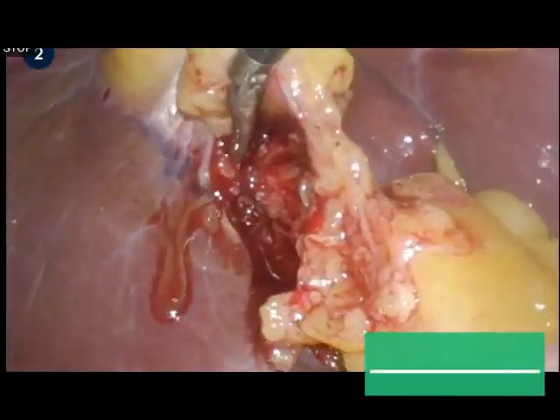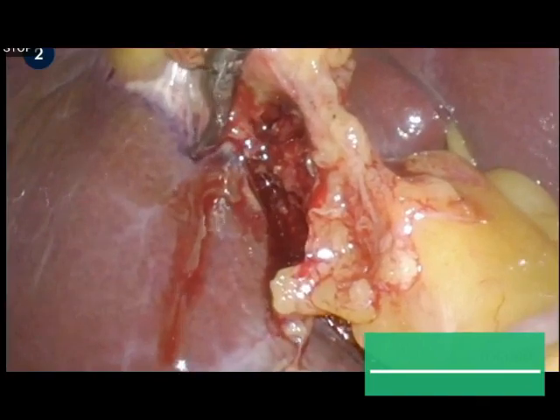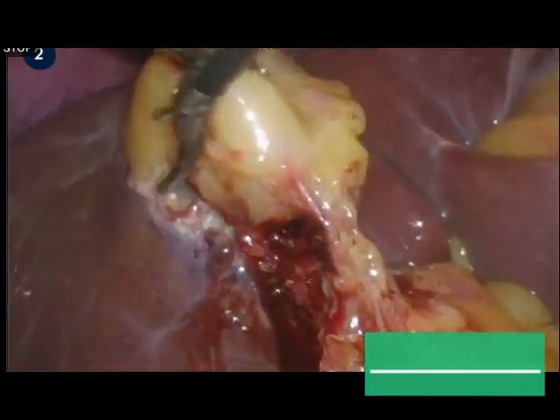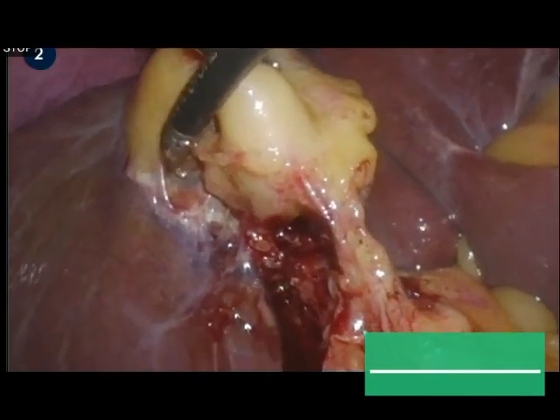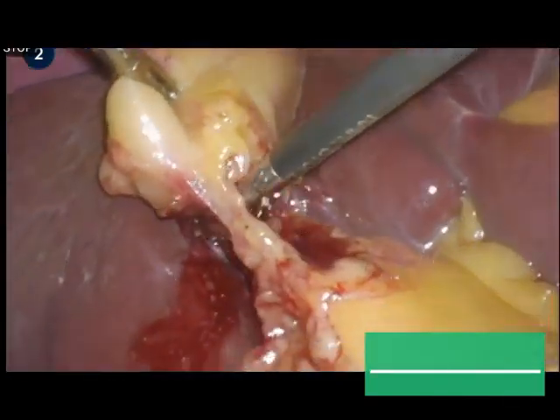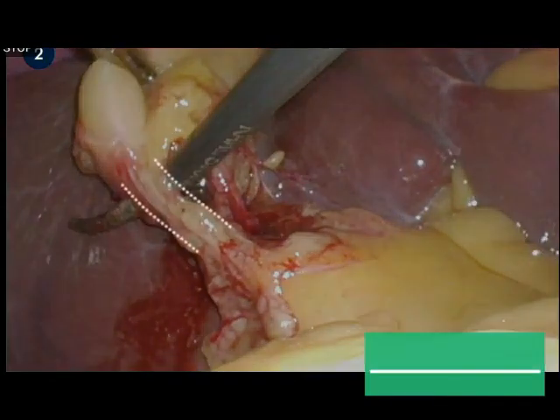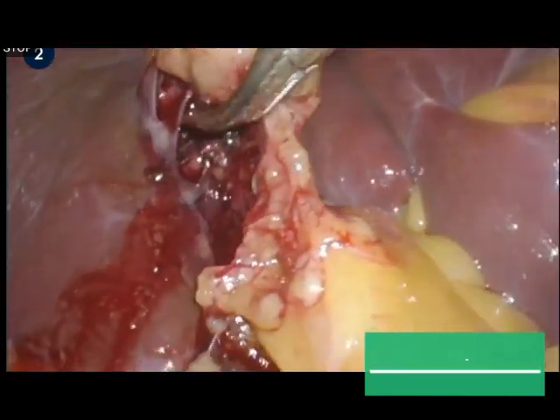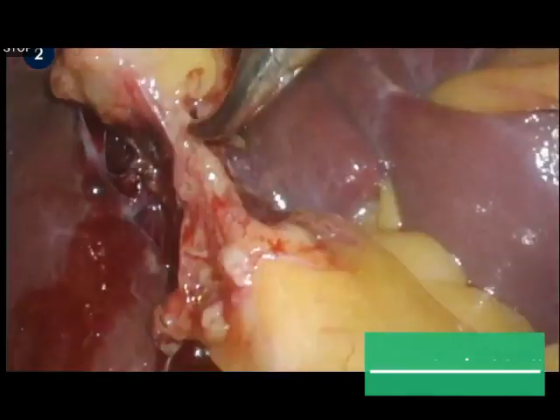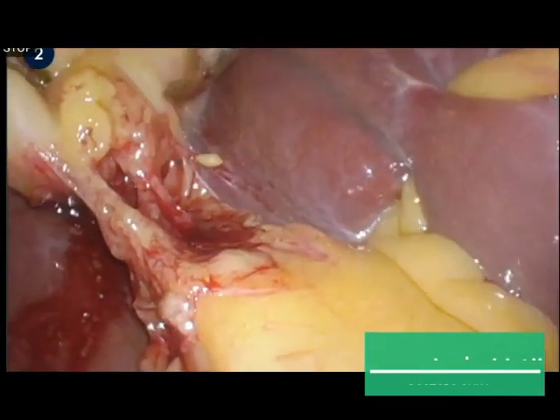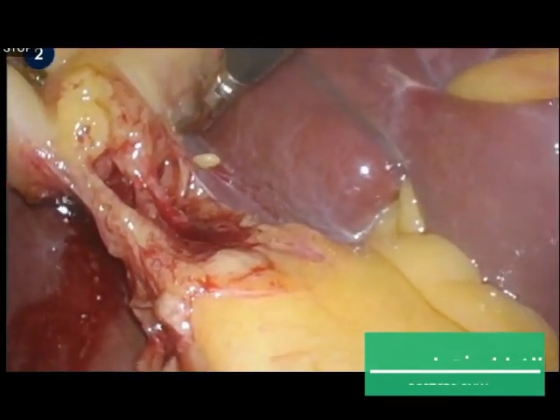The lower one-third of the gallbladder is dissected off the liver bed. Here, a tube-like structure is identified, which may be a biliary duct or artery. These structures are isolated close to the infundibulum to prevent damage to the common bile duct.